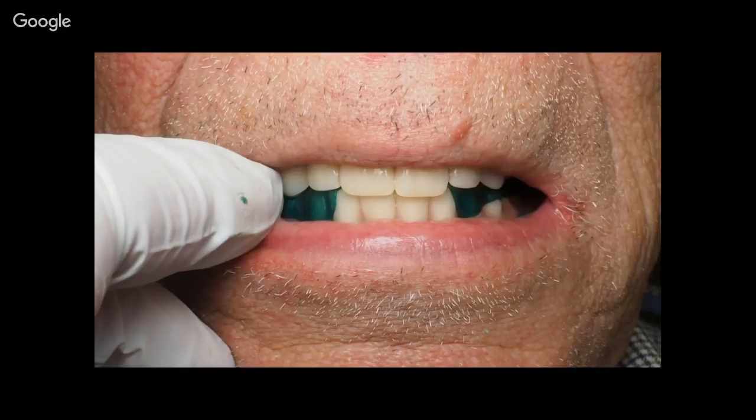Well, one of the things I was taught in a little weekend course forever ago, I think the prosthodontist's name was Nadir Sharifi, is he turned me on to this stuff called occlusal indicator wax. It's made by Kerr. You can get it from pretty much all the big supply houses. These are really thin sheets of green wax that are already pre-cut into little rectangles. What you can do is run those through a flame once or twice, get them soft, and then I just press them over the posterior teeth.